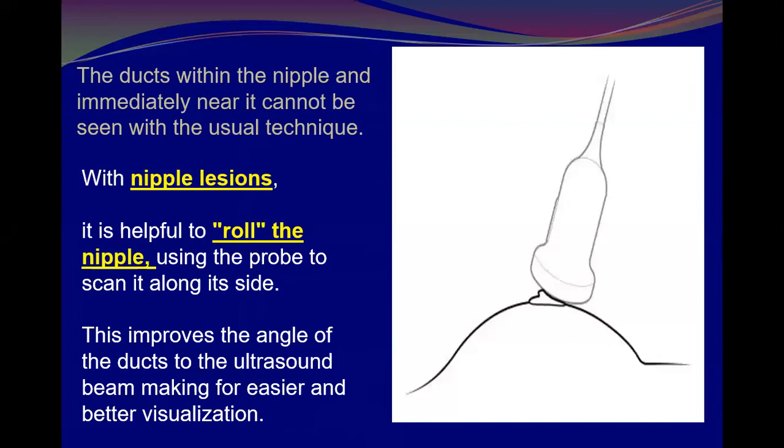But we can also use other techniques to evaluate the nipple area, especially to visualize the duct, by rolling the nipple using the transducer itself.